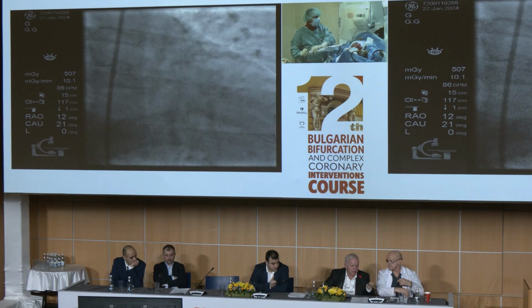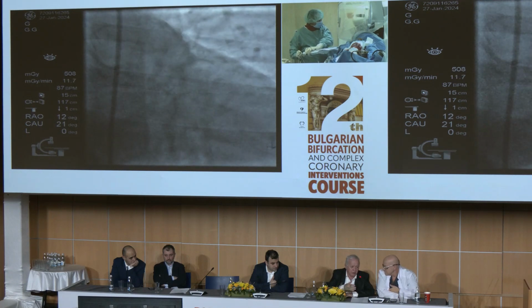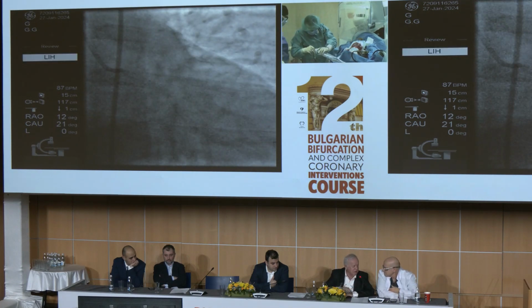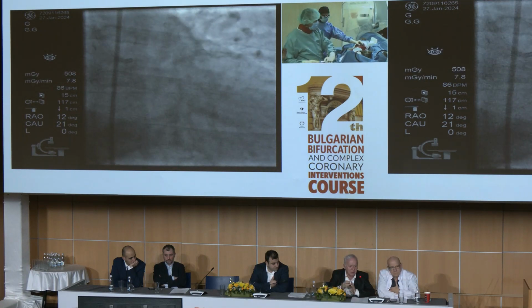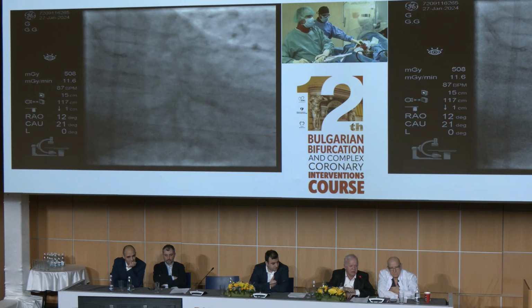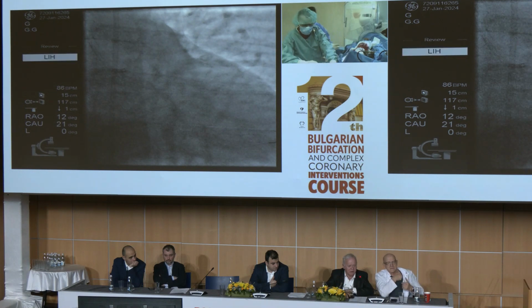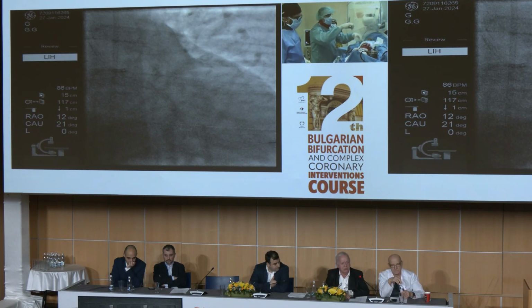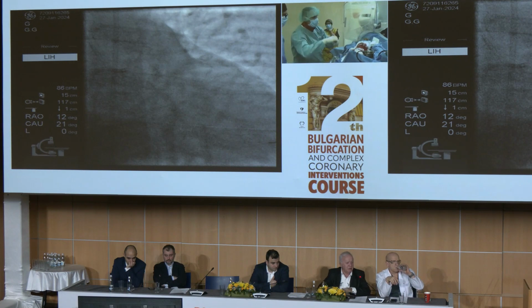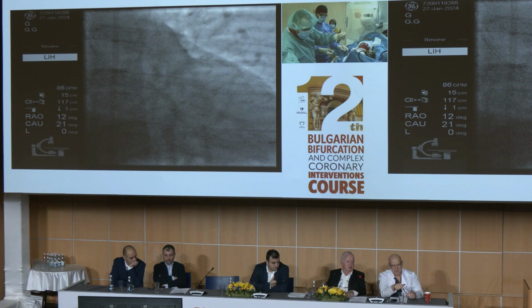Yeah, I will do exactly the same as you, high pressure balloon. It is not as calcified as the LAD, then the stent, and we choose properly the length to avoid stenting inside the aneurysm, because we will probably leave an incorrect deployment of the stent there, and after that move to the LAD. If you have shockwave, we try to avoid doing rotablator on both sides in the same session, which is normally not a problem.